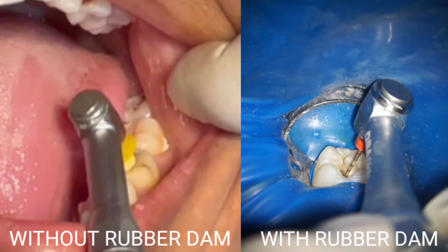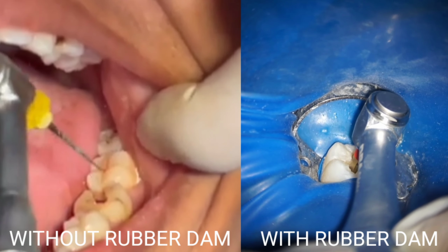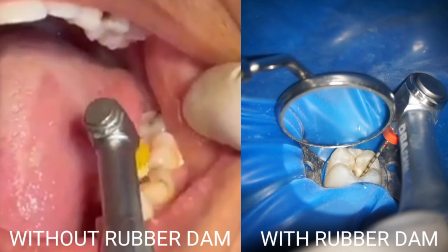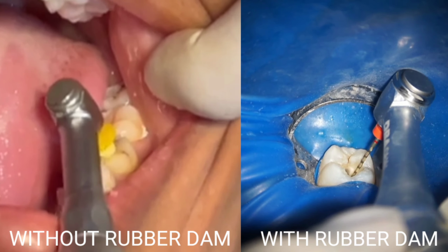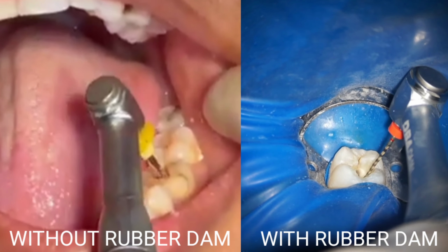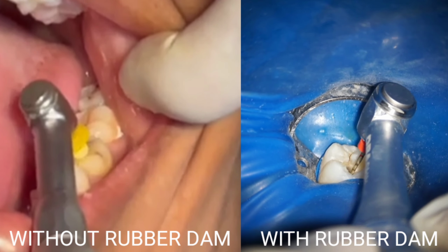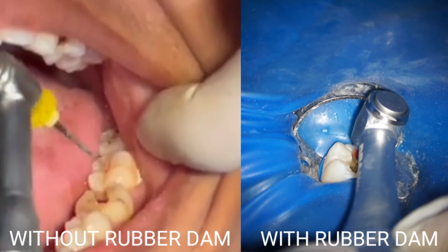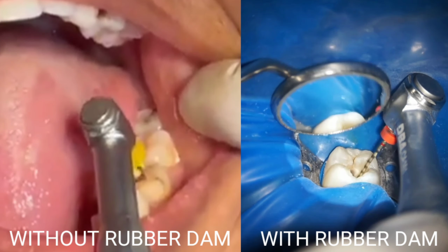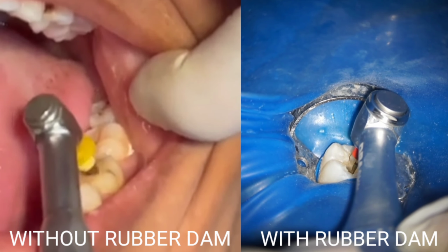Yes. That is why protection of the tooth and the adjacent tissues in which that material is being used is very mandatory, and it is mandated by the law. But 95% of people in our country do not use this protection that has to be used for the patient, owing to cost factors, which is very wrong, which we want to highlight through this video. We'll be showing you a video which will show you the difference of how it is applied and how we use it. Yes.